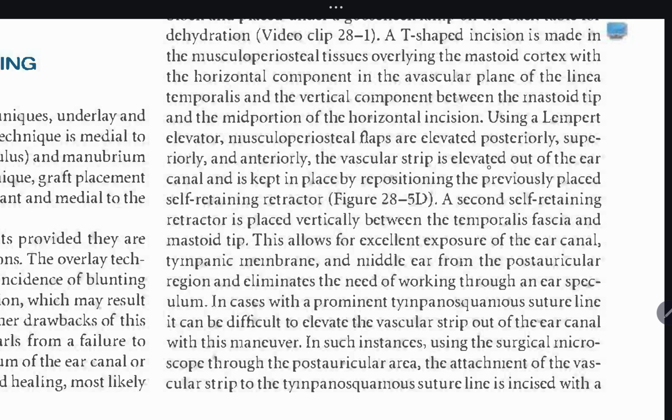The vascular strip is elevated out of the ear canal and is kept by repositioning the previously placed self-retaining retractor. A second self-retaining retractor is placed vertically between the temporalis fascia and mastoid tip. This allows for excellent exposure of the ear canal, tympanic membrane, and middle ear from the postauricular region and eliminates the need of working through an ear speculum.